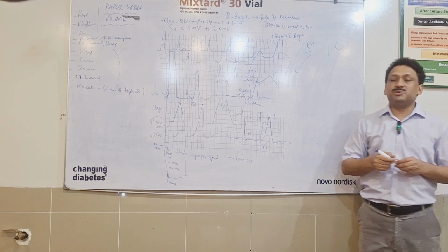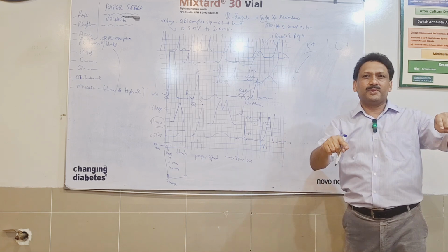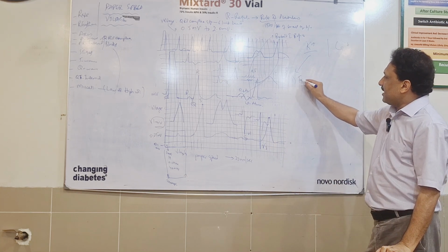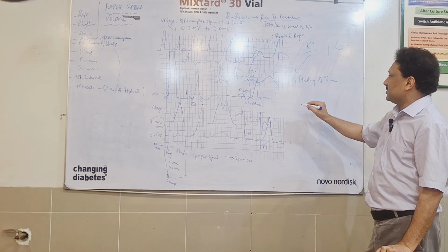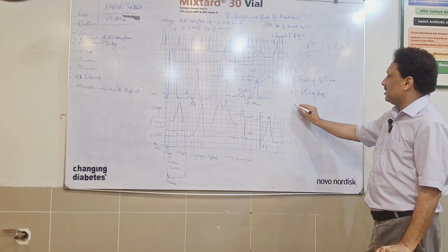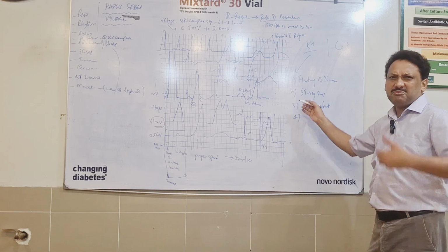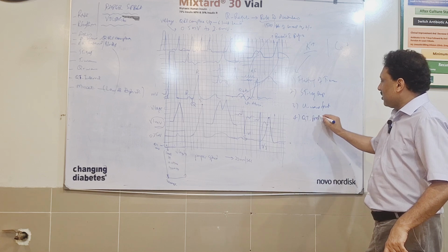Calcium changes are not many, but as far as the potassium changes are concerned, they are classically 3 to 4 changes. As the potassium keeps on going low, you keep seeing different changes. The first thing is flattening of T waves. That's usually the first thing which appears. The second thing is ST segment depression. The third thing is then U wave formation. And the fourth thing, usually these things are combined together, is QT prolongation.